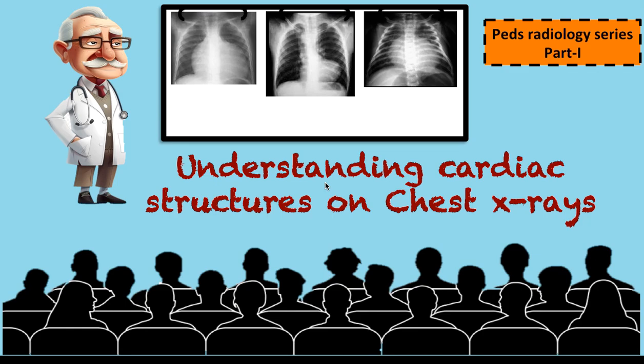Hello friends, in today's lecture we are going to talk about how to interpret and make a diagnosis of cardiac conditions only on the basis of chest x-rays. Chest x-ray reading is an art itself and requires good knowledge of human anatomy as well as experience to make a right diagnosis. This is the first lecture in the pediatric radiology series and subsequently more informative lectures on this topic will be uploaded.